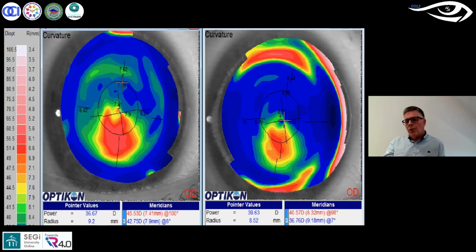Now, if we go right back to the beginning where we were screening a patient who was fully unaware of her keratoconic condition because vision was very adequate, this is a very, very similar situation. So our optometrist friend has managed to fit himself almost with regular mainstream soft contact lens and correct his keratoconus to a very, very acceptable level.